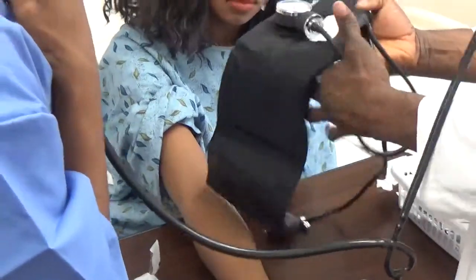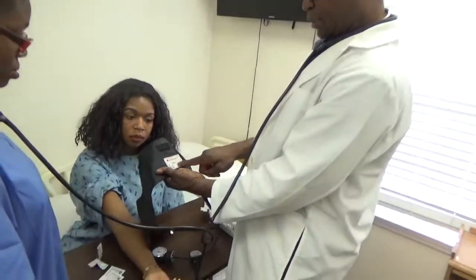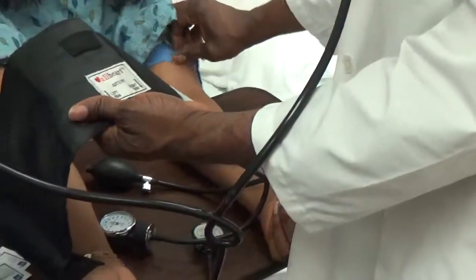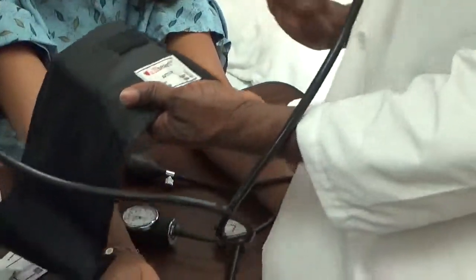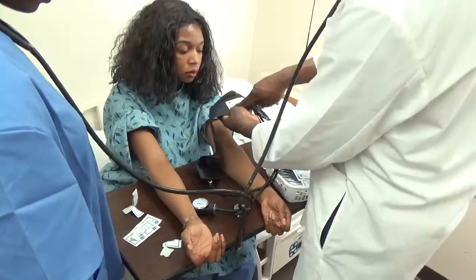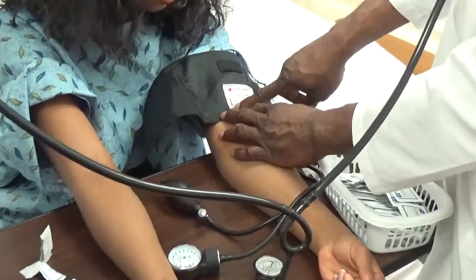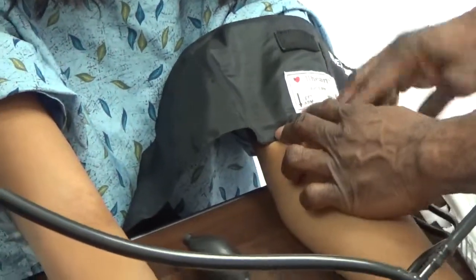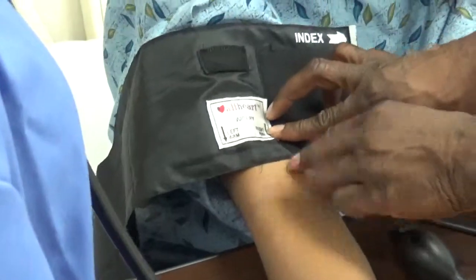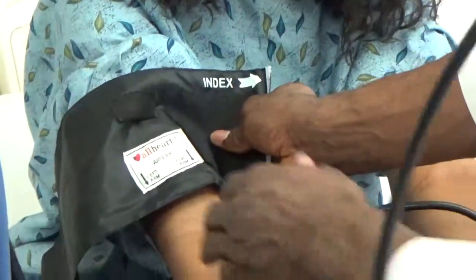Next, wrap the blood pressure cuff. Before you wrap it, look at the information on the cuff — it says artery, left arm; artery, right arm. If you are wrapping the cuff on the left arm, after you locate the left artery, make sure the left arm arrow is pointing to where you located the artery. If you are using the right arm, make sure the right arm arrow is pointing to where you located the artery. We are using the right arm, so we are going to wrap it now.